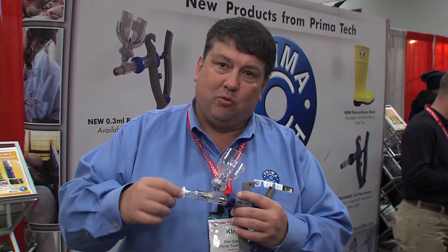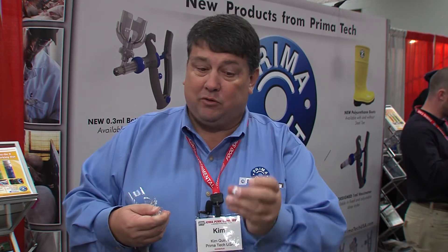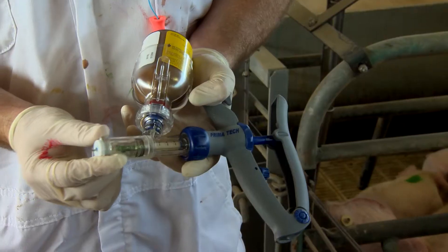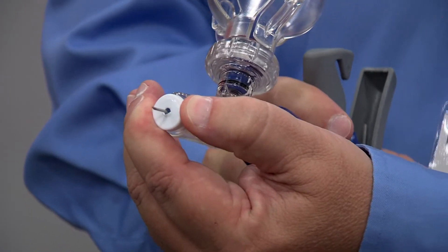There's a little cap here that twists off. This gives you a disinfecting cap for the needle to pass through. This cap is good for 100 injections — it will sanitize the needle 100 times. The needle passes through that hole and every time it passes through, it washes and cleanses the needle.